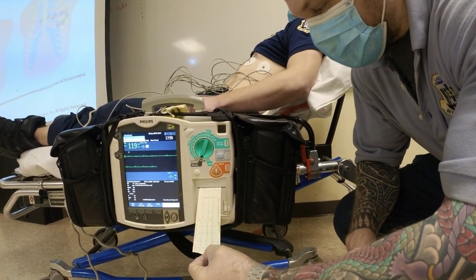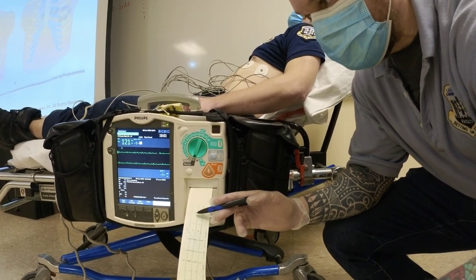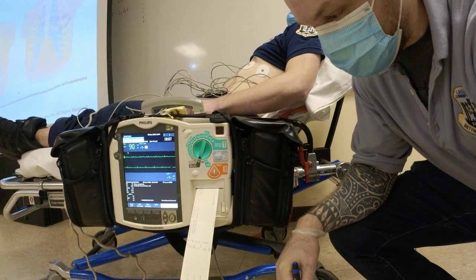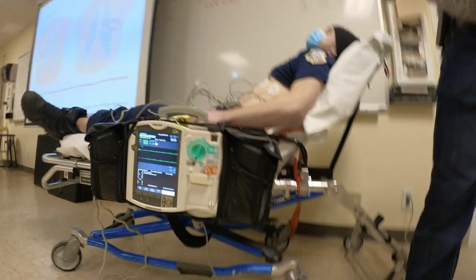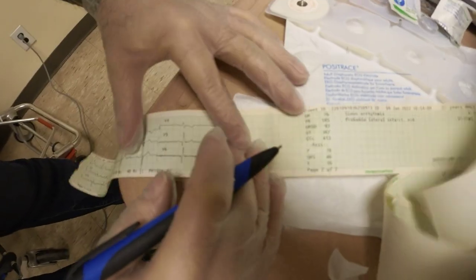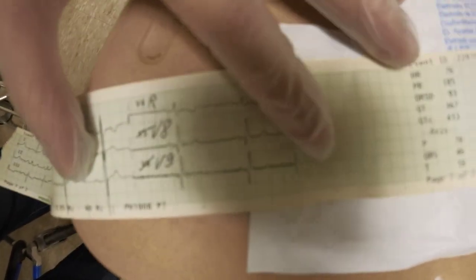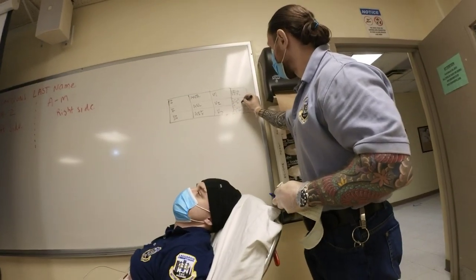So it's going to come out. The interpretation, if they were elevated, is going to tell you erroneous, right? Because now we know we applied it at different locations. So the moment it comes out, all I'm going to do is here. I'm going to relabel V4. It becomes V4R. You able to see? So V4R. This becomes V8, this becomes V9, right? And so what I basically did to show you here, V4R, I write like this, V8, V9.